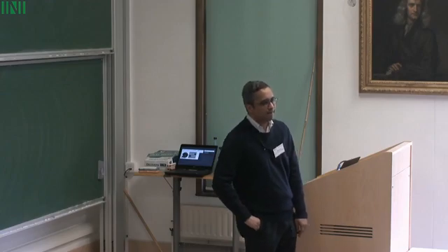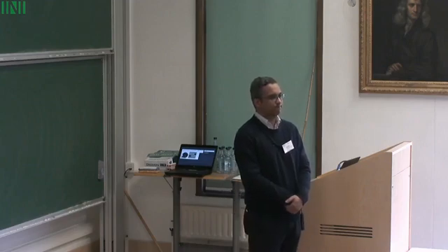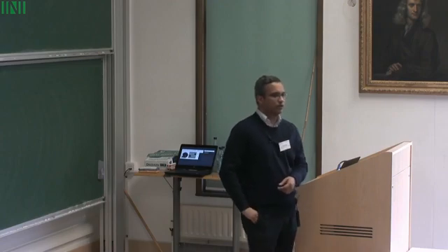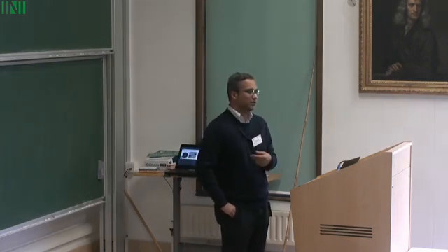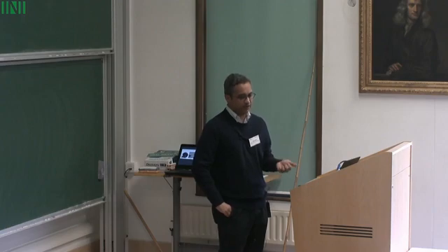And for the segmentation part, you showed that you use deep learning for 3D segmentation. Can you mention which model this is, and which organ as well? So we have models, as I mentioned, for pelvic CT, head and neck. Like 3D U-Net? Yeah. So the applications I showed were for pelvic CT, head and neck, and brain, and the underlying model is a variation of 3D U-Net. And we've also built something known as autofocus networks, a combination of all of those.